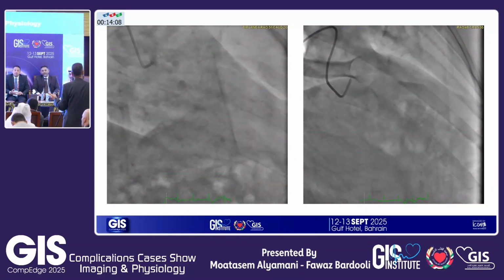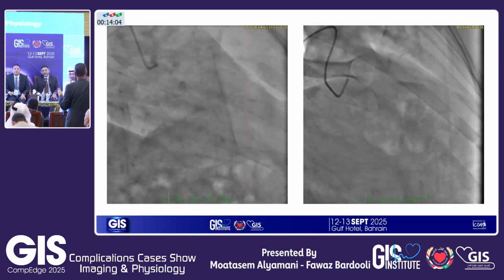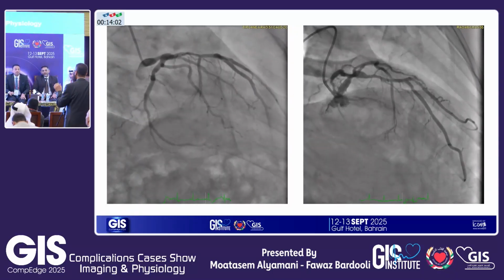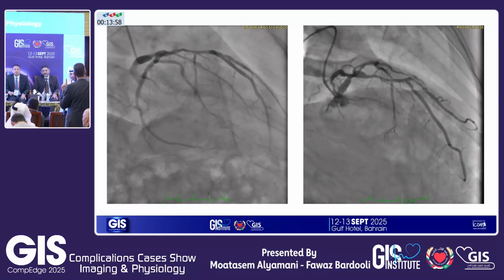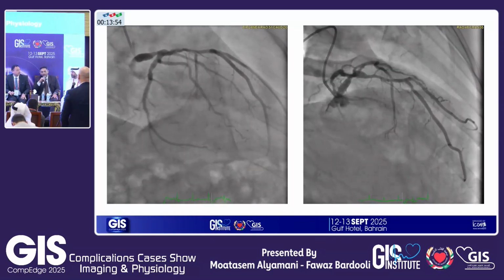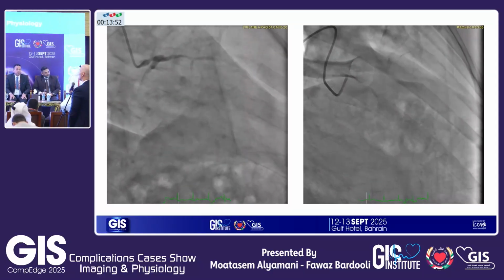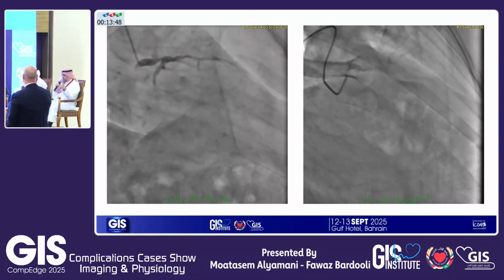If there is still a question, I will use IVUS or OCT to characterize the plaque because that will make more difference. And we have an approved minimal luminal area for IVUS in terms of left main. So I'll go with the imaging if there is doubt. And the other reason to go over imaging is vulnerability of the plaque and plaque burden, the volume of the plaque burden, if it's more than 60% or something.